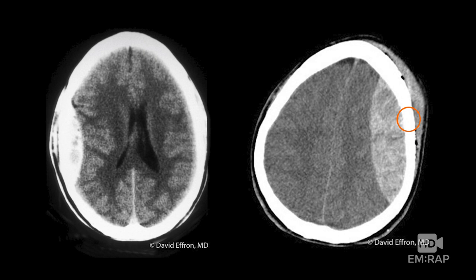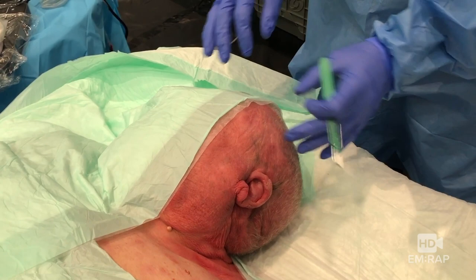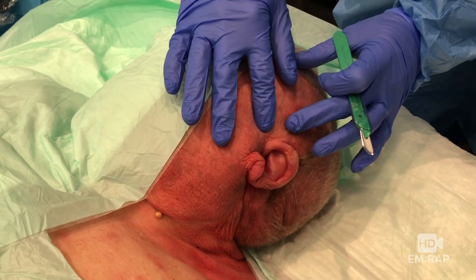Use the CT scanner for site selection. Measure the depth to the inner table of the skull and set your stopper to this maximum depth. If no CT is available and you must proceed blindly, it's 2 centimeters anterior and 2 centimeters superior to the tragus on the ipsilateral side as the blown pupil. Palpate the superficial temporal artery and stay anterior to it, though it is very likely you will transect the frontal branch, so be prepared to manage bleeding. It also helps to inject lidocaine with epinephrine.